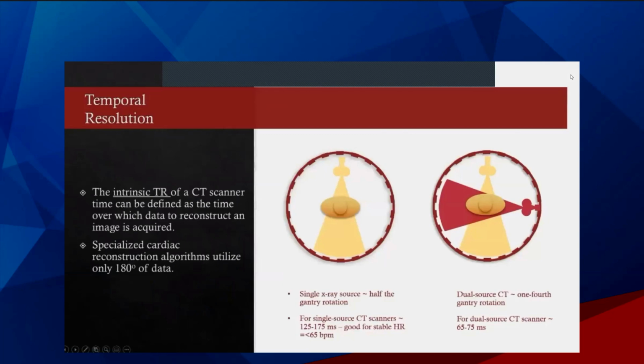Trying to understand temporal resolution a little bit better, we know that specialized cardiac reconstruction algorithms use information obtained from 180 degrees of gantry rotation to create a single image. This is what it looks like for a single detector.